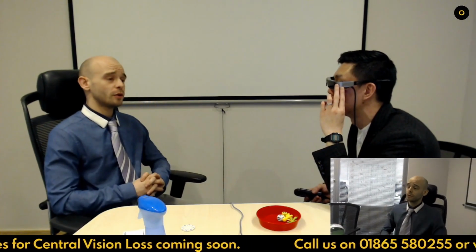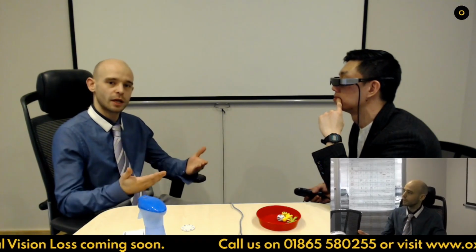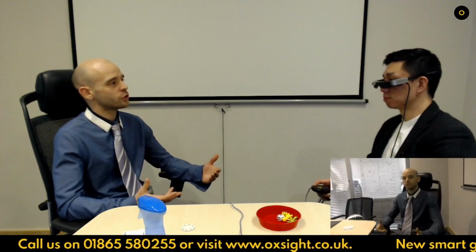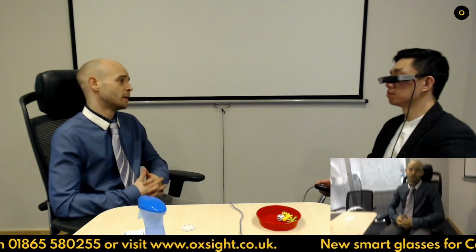And generally speaking, people who have good clarity, if they have very reduced field of view but good clarity, can get the maximum out of the glasses. If somebody's got very poor clarity, so a visual acuity that makes it very tricky to see things in great detail, then what you were doing a moment ago with zooming in, although they're probably not getting any increase in field of view, the actual magnification of what they're looking at makes life a little bit easier to negotiate or have a conversation with somebody.